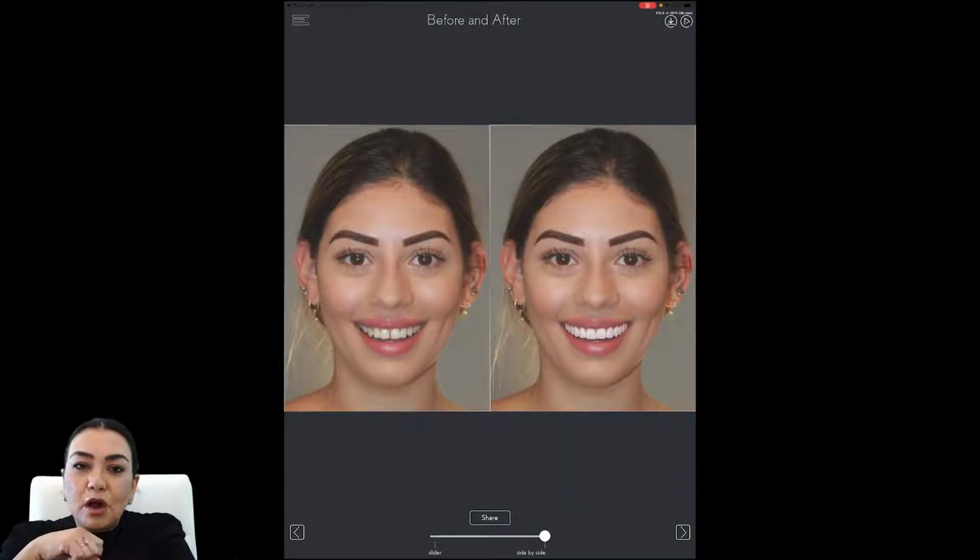Just let me ask you one question. How many of you already heard about your patients phrases like this? Oh, I need to check my financial. I need to discuss this with my husband, or I need to discuss this with my wife. So this is something that they can bring home. You can easily share the before and after picture, and they can keep this. You can send through text message or via email.